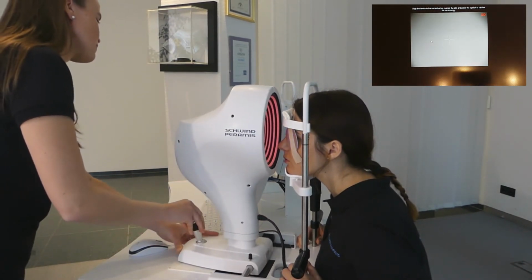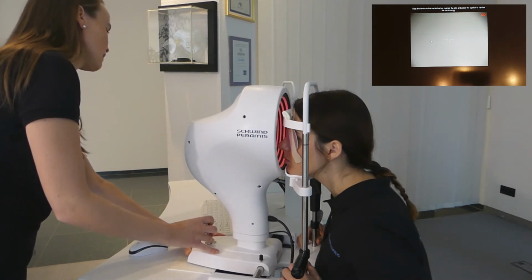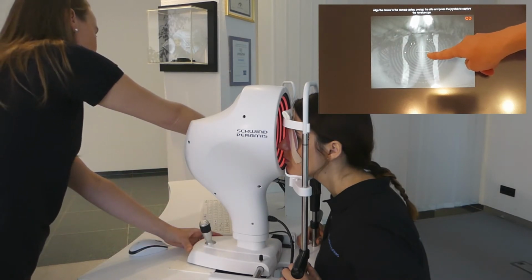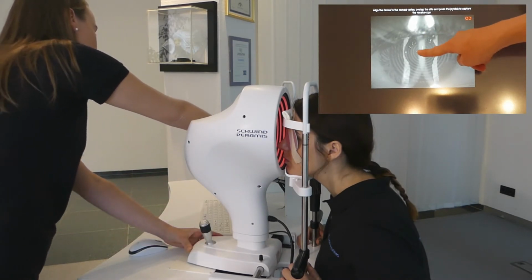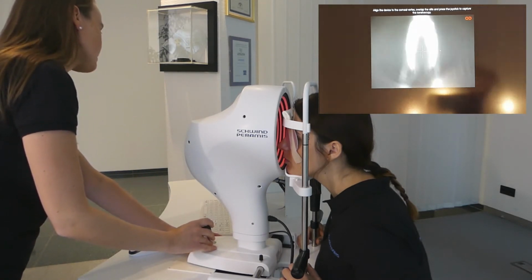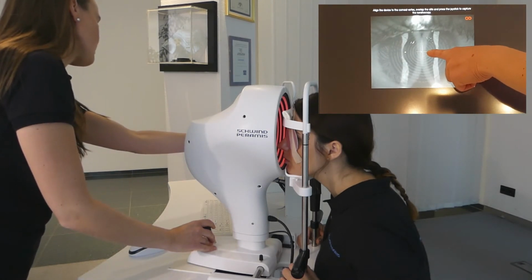First of all, I'm searching for the eye of my patient. And you see in the center there is a white spot, and you see also a white cross. First of all, I have to center this white cross to this small little spot.